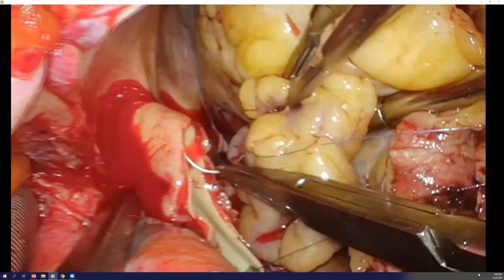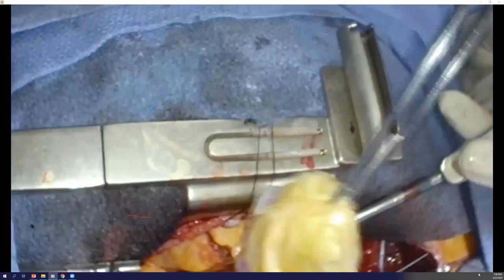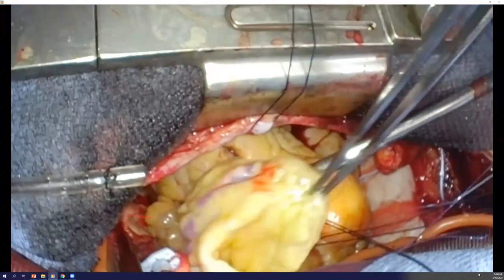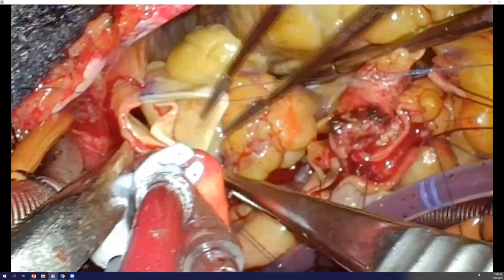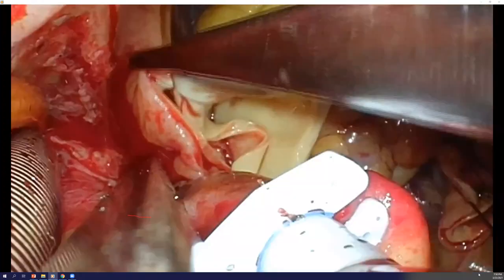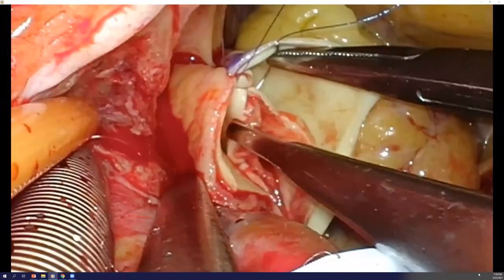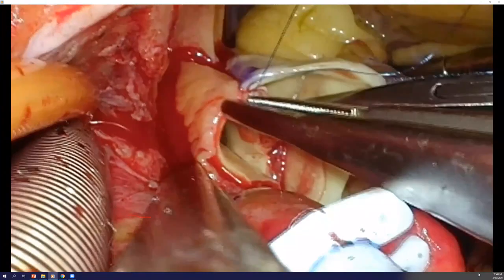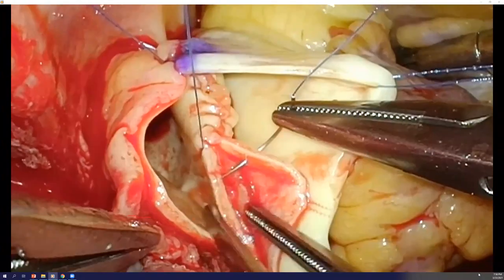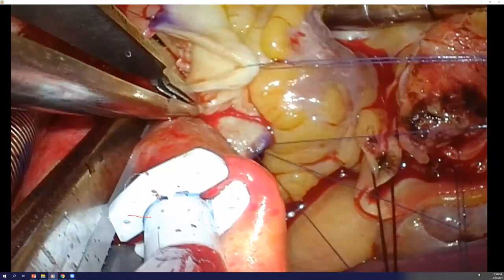I don't know if you noticed, but I always cannulate in the aortic arch when doing any heart surgery, but more importantly, when doing a Ross. And that allows me to keep the cross clamp as high up as possible, just proximal to the innominate artery. And what that means is that the distal anastomosis for the PA is actually made a lot easier, as opposed to if you cannulate the distal ascending aorta, your clamp is then even more proximal, and that makes this anastomosis a little bit more challenging.